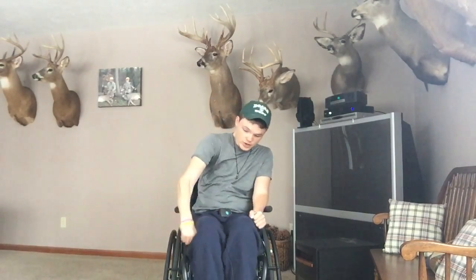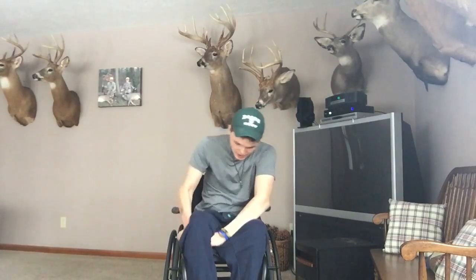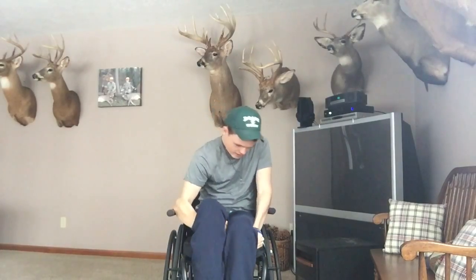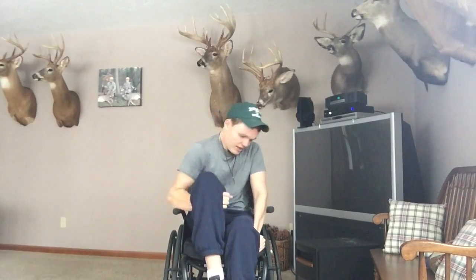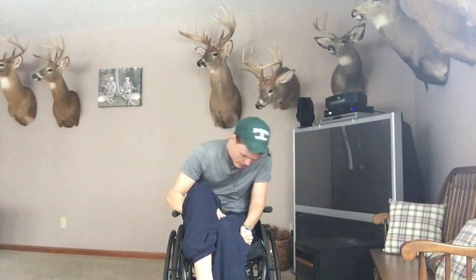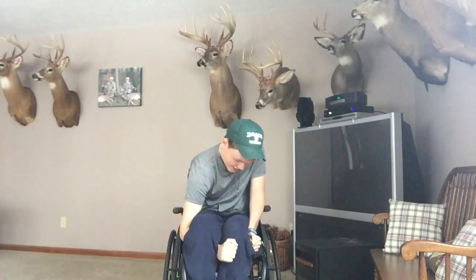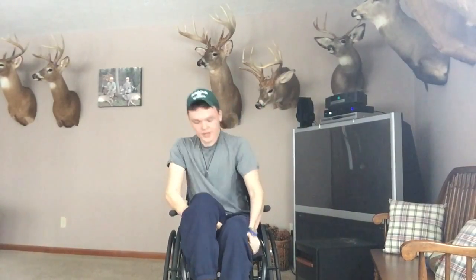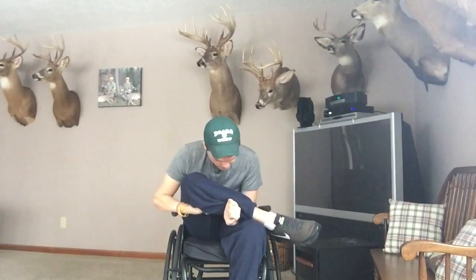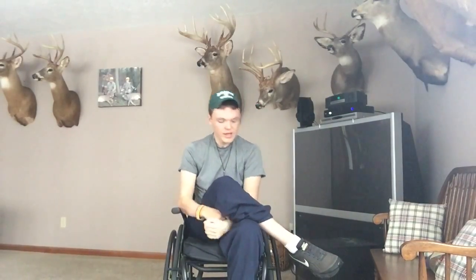The third way to do a pressure relief in a manual chair is to put one leg over the knee of the other one. For me this is a little bit difficult, but basically just pull it up as much as possible, and you might have to use your armrest to get some leverage, and put your other arm under your ankle and try and get it over the other side, which is a little bit tricky for me, but you can get it with a little bit of time and practice.